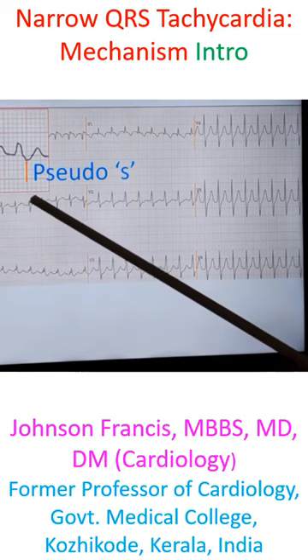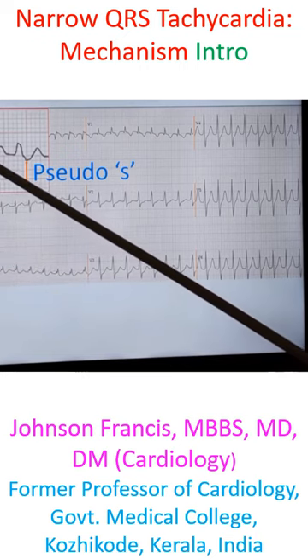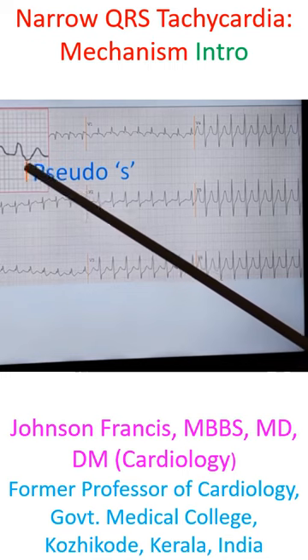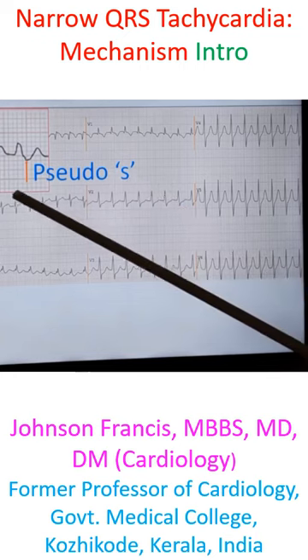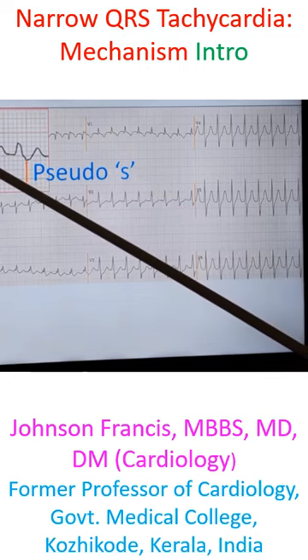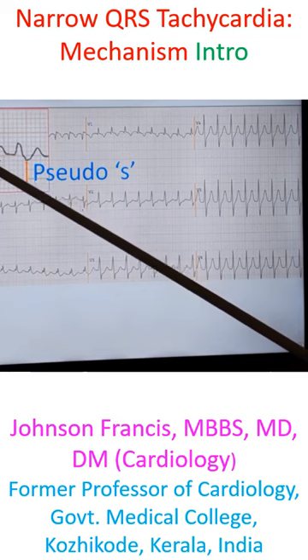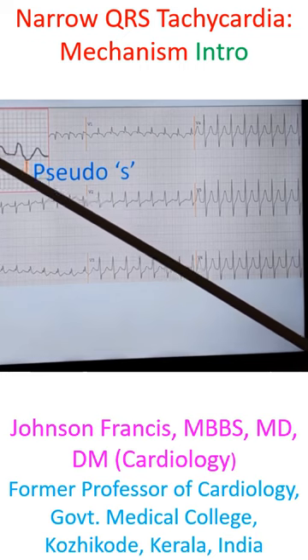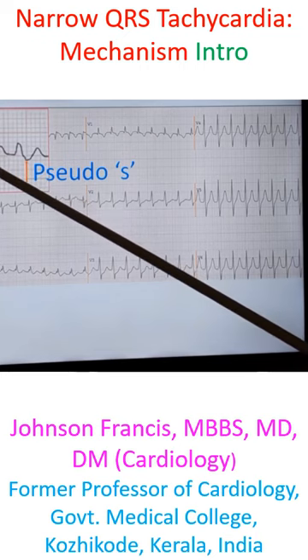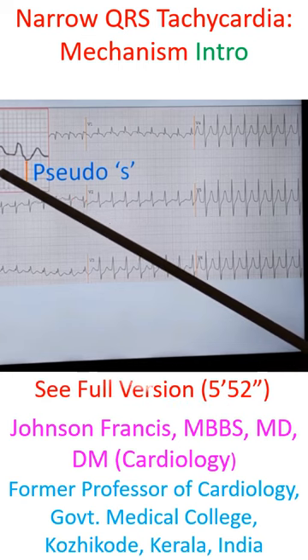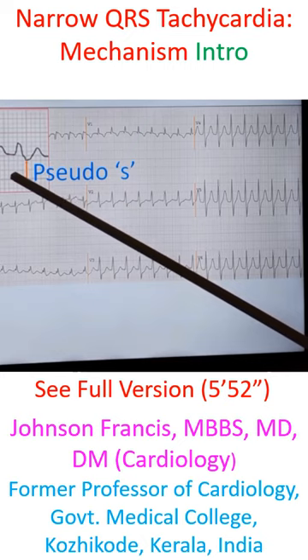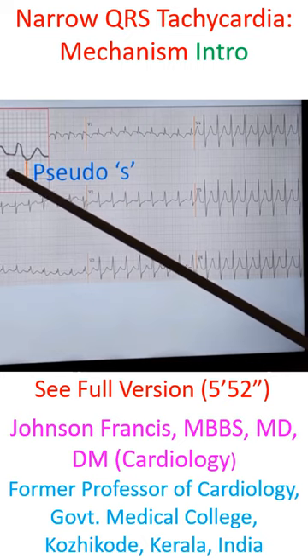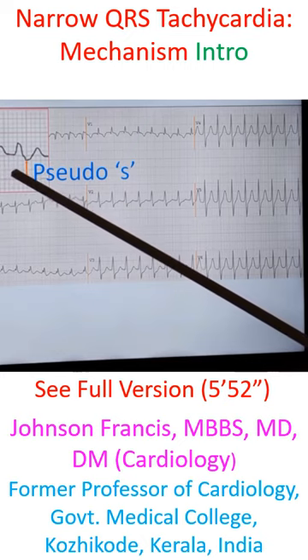In this type of tachycardia when such retrograde P waves are seen — this is an amplified view — they are known as pseudo S waves because they appear like an S wave after the QRS. The R wave is here and this could be called an S wave, but they are very small and not true S waves. They are retrograde P waves which appear negative in this lead.